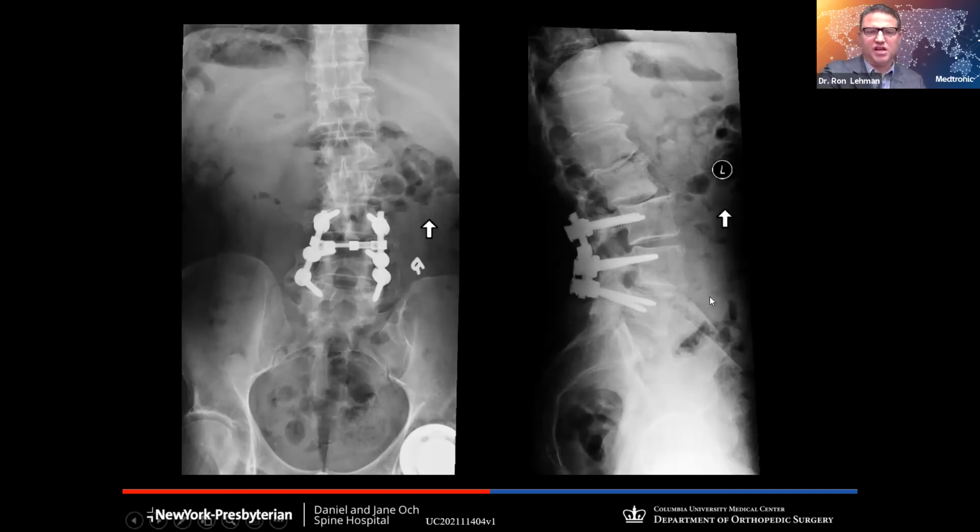This patient has a pretty solid posterior fusion, prior laminectomy there at 4, 5, which we can see. So radiographs really help us quite a bit. Nice posterolateral fusion here and posterolateral fusion on the contralateral side at 4, 5. So we know they're pretty solidly fused comparatively.